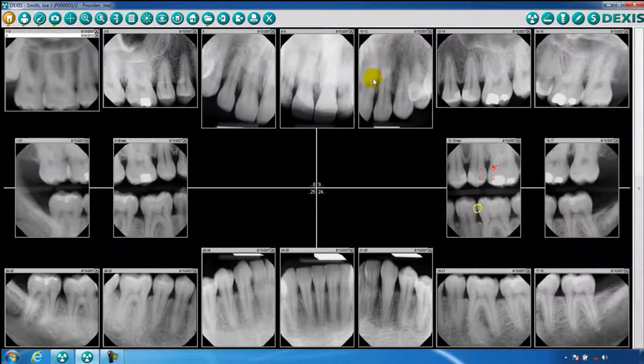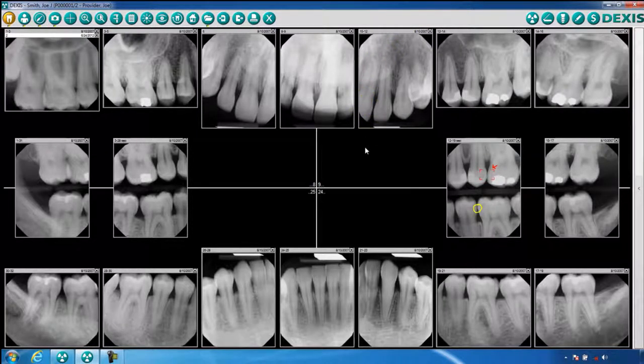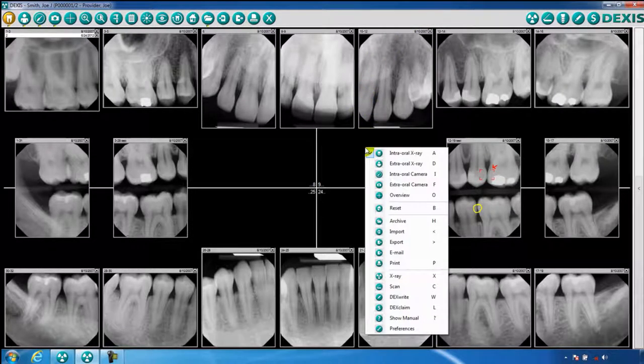The option to use the right-click is also available from this screen. When you right-click, you are given the ability to access many DEXIS functions, which correspond with the functions on the toolbar.